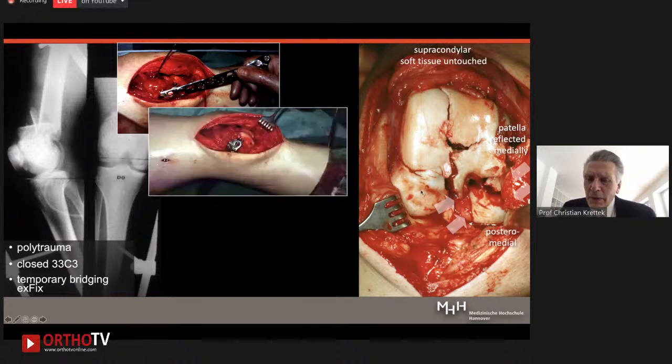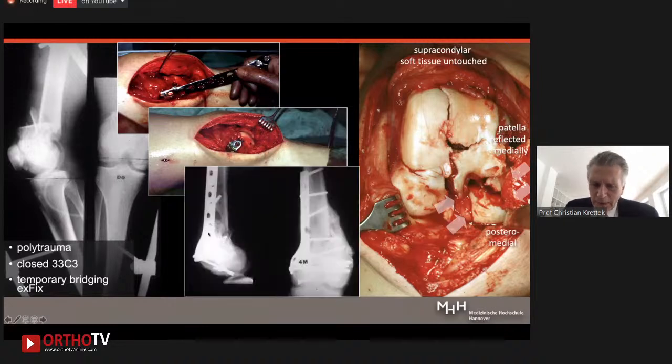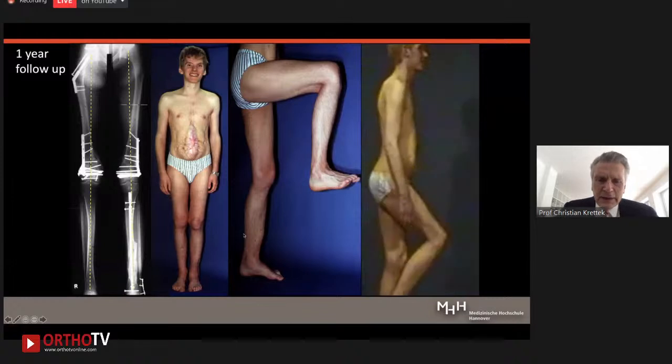Inserted plate component, which is then fixed to the articular block and percutaneously to the femoral shaft. And look here at the 4 months X-ray, how nature thanks us for the preservation of the soft tissues. There is no primary and no secondary bone graft, and the regenerative power of nature fills the defect and bridges on the medial side, which leads to good fracture union.